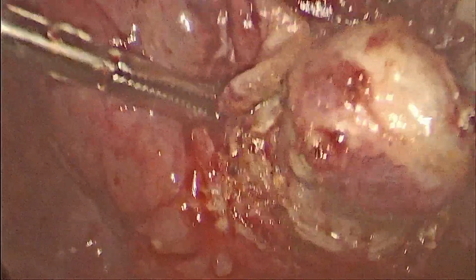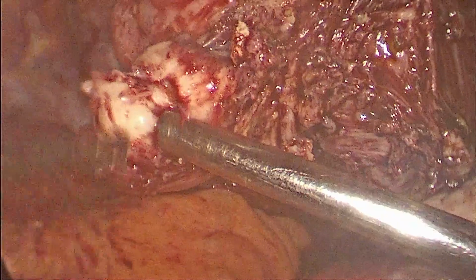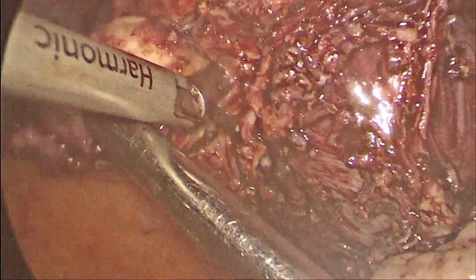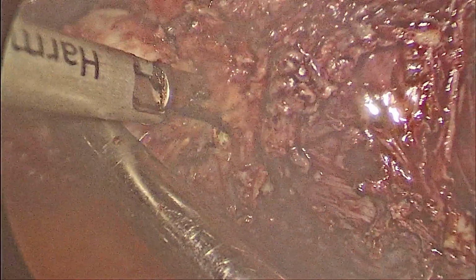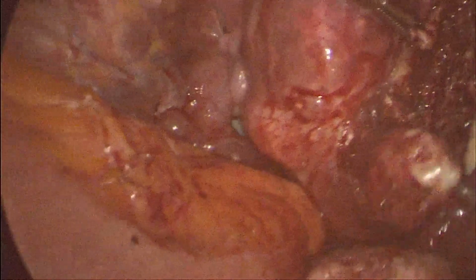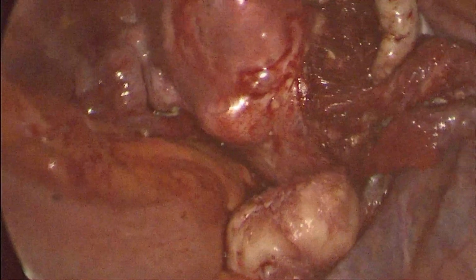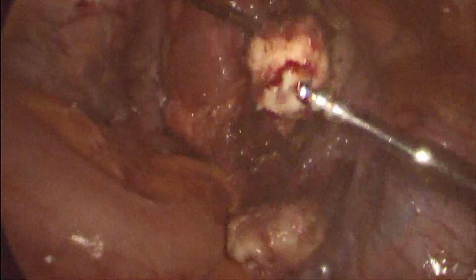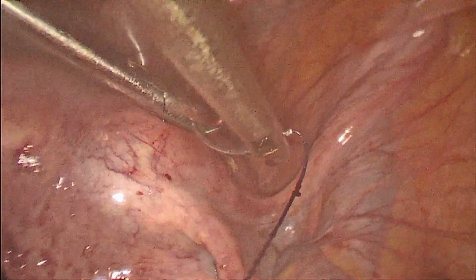As we remove more and more myomas, the shape of the uterus becomes near normal, which may improve the chances of fertility, as multiple fibroids in the uterus have an effect over the vascularity of the uterus.